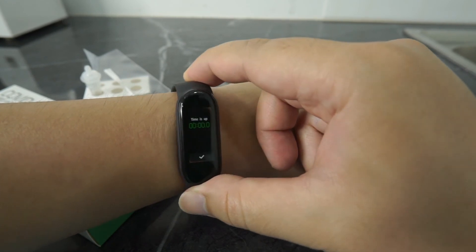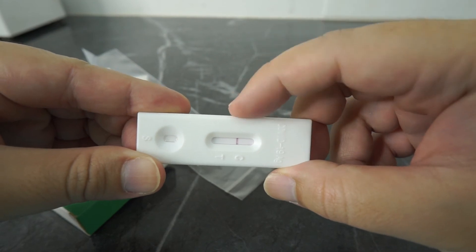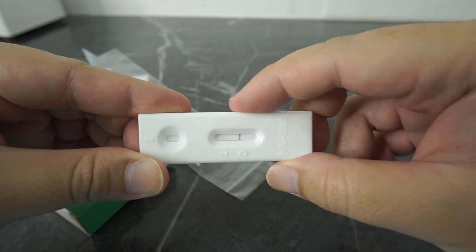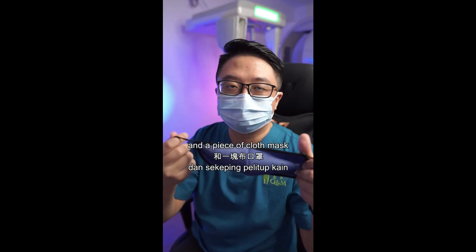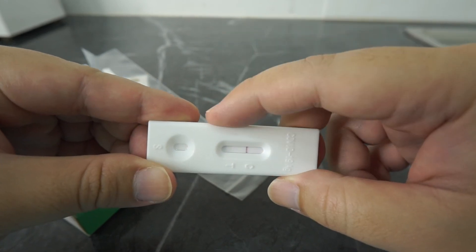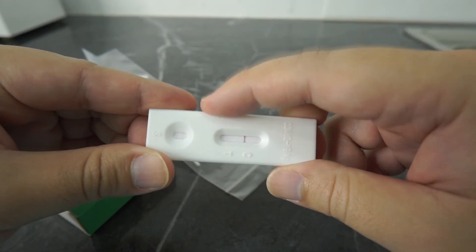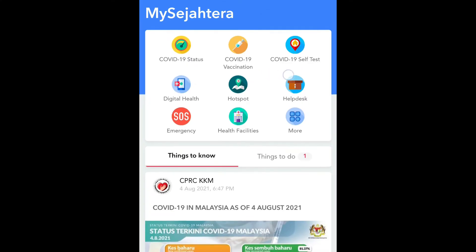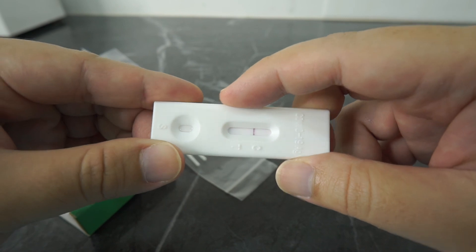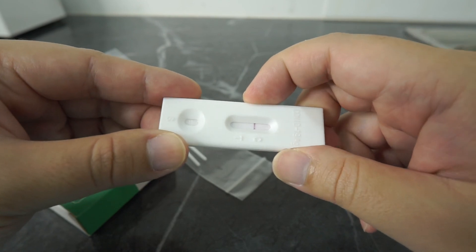Result time — how do we read the result? Just like a pregnancy test, if you have only one line at the C level, you are COVID negative. You must still continue to practice social distancing, do regular hand washing, and wear a face mask. If you have two lines at C and T level, this is an indication that you are positive for COVID-19. You should self-quarantine immediately, update your status in MySejahtera, and contact your nearest government clinic or hospital. You may be required to do another round of PCR test to confirm your results. If you don't get any lines, or if you have only one line at the T level, you should repeat the test using a new test cassette.